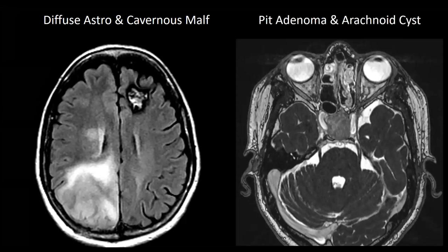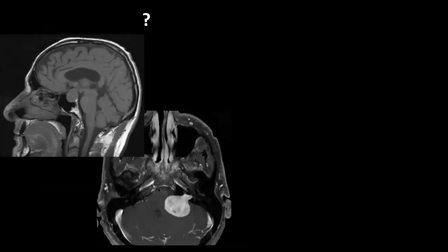All right, let's do another one. Again, look at that pituitary adenoma. You have to be able to recognize that this is the sellar region, a macroadenoma filling that sellar region. You have to be able to identify it on an axial, not just on a coronal or a sagittal, which are our favorite series for looking at pituitary adenomas, because we see the sella and the suprasellar space together. We really love that. But you have to be able to recognize it on an axial, and on a T2, not just on the T1 with a hypo-enhancing area. And that arachnoid cyst of the left temporal pole is much bigger on other cuts. I like to show just the one cut that's effective, but I can't show you one cut on all the patients.